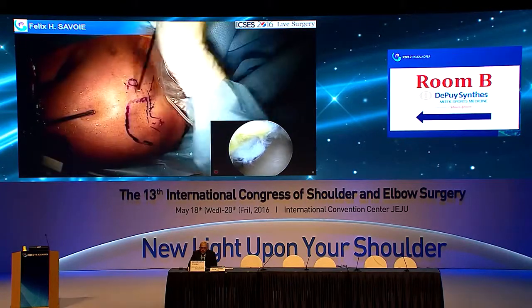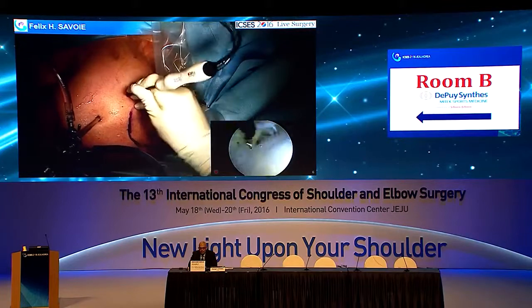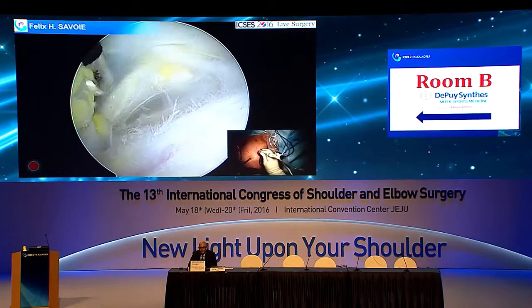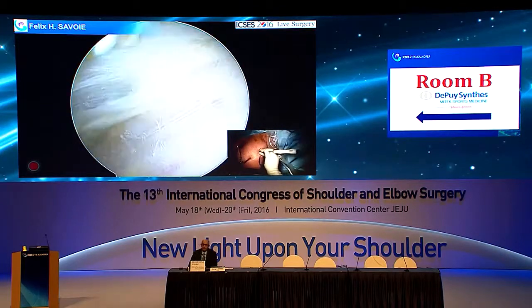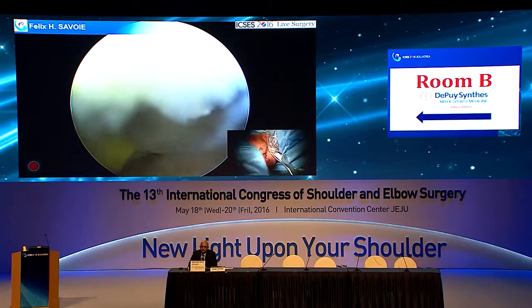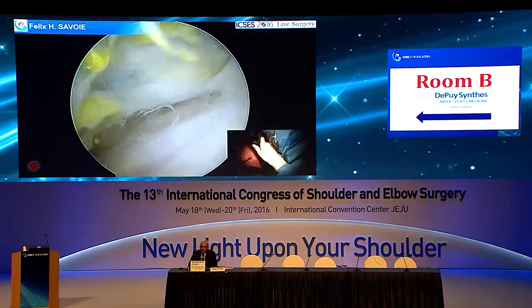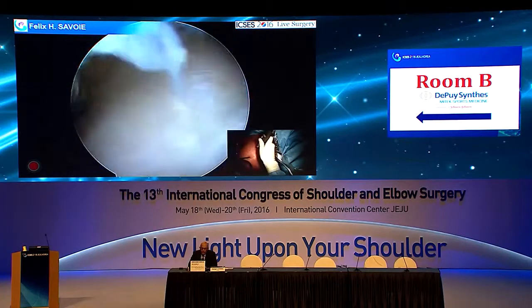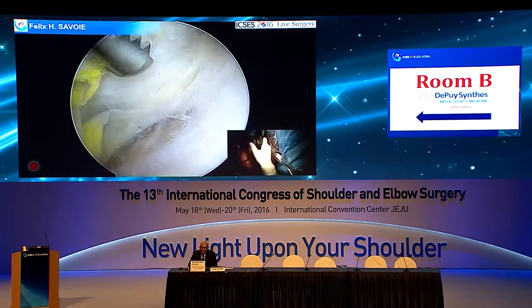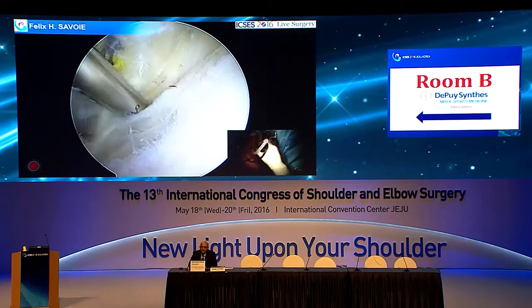Hey, what are your thoughts on the coracohumeral ligament? I'm fixing to go show it to you right now. So I think almost no matter what, you want to release that. So here you see the conjoint tendon coming right here. I'll tell you what, let's put a shaver in and I'll clean that up real quick so you can see it better. That's not really a good view of it. Now, we want to come in with this one lateral to our CA ligament. We'll come back here. So there's the CA coming in.